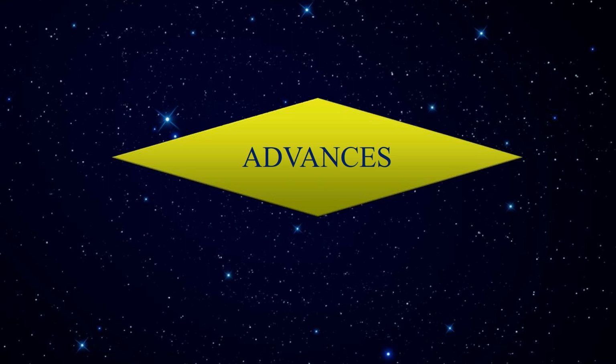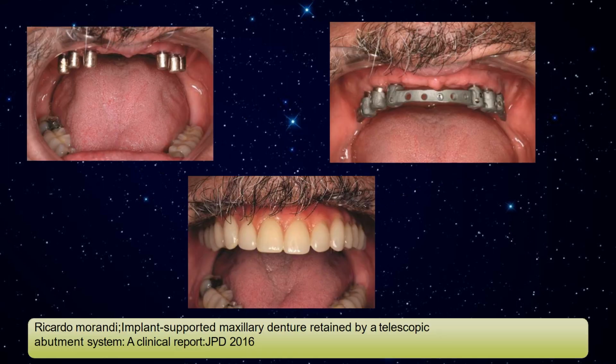So then we have the advances we have already talked about. CAD CAM designing has revolutionized the fabrication of implant dentures, and in cases of oral rehabilitation also we can use CAD CAM for designing a digital or CAD CAM milled complete denture.